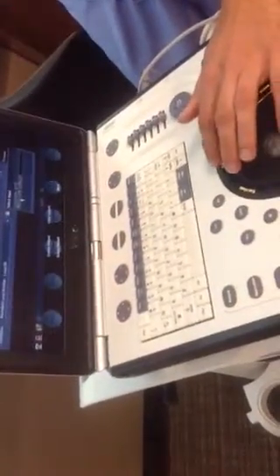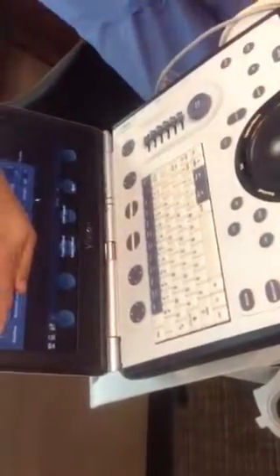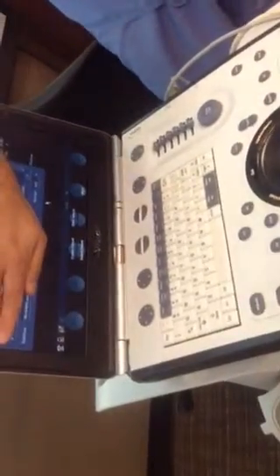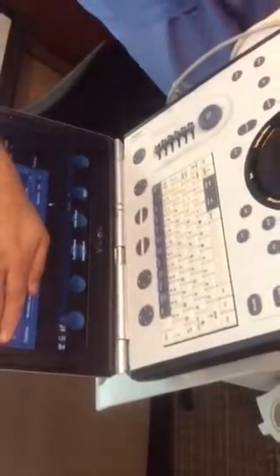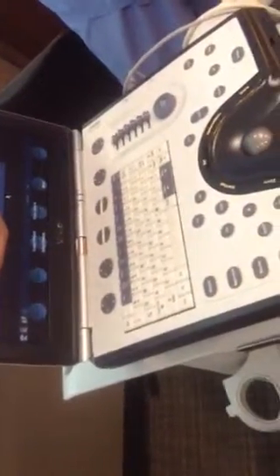Somebody take notes. Write this down. This is extremely complicated. You will forget. So now on top, have someone write the steps down. And I'm making a video. You're gonna watch an hour of video. We have it written, and I'll pass it on to you guys. Okay. We have it written.